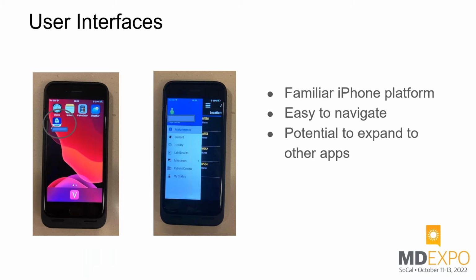This does not have anything to do with that. This is strictly the alarm notification from the telemetry. As I mentioned, we have 221 telemetry beds. For the alarms we selected, I do have a slide, maybe more of an eye test, for the red, yellow, and blue alarms, if you're familiar with the Philips system, which I know is very similar on other vendors as well. We selected a subset of those alarms through the clinical alarms committee that we talked about, which helped us decide which of those alarms will now be going to the iPhone.